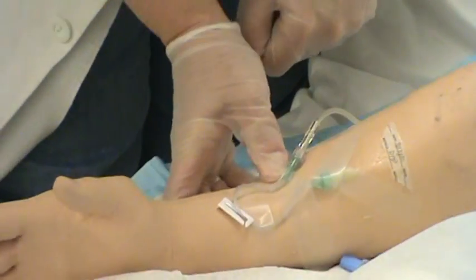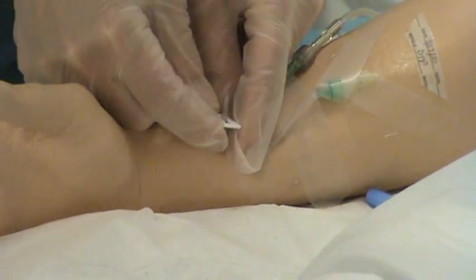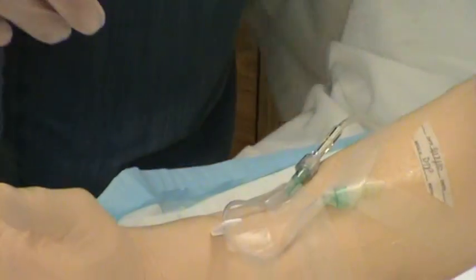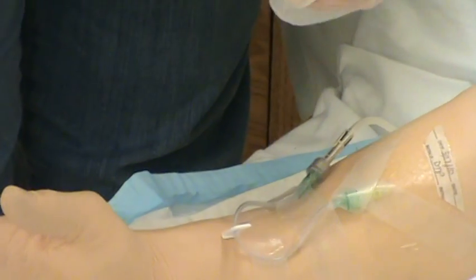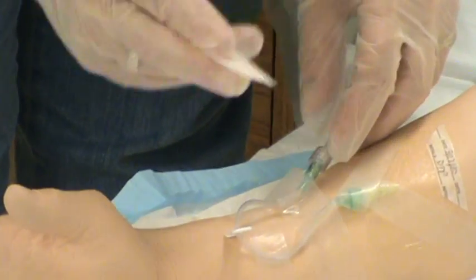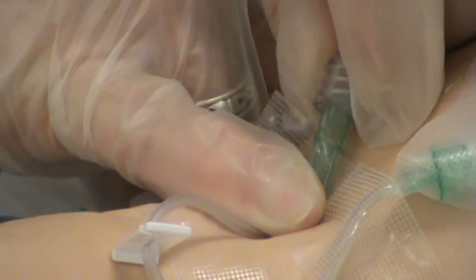Now what I want to do here is slide this slide clamp closed. That will prevent blood from coming at us if it were going to happen. Okay, we've got that clamped, we've got our bags clamped, and now what we need to do is to take off the old tubing while protecting the green hub, keeping that sterile. So this is going to serve as my little sterile field, and I'm going to do my best to do this while you can see what I'm doing. This comes unscrewed.